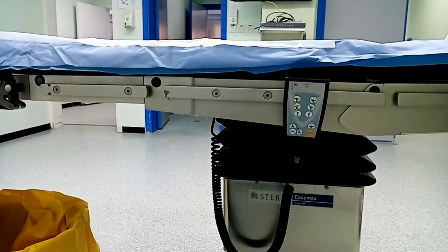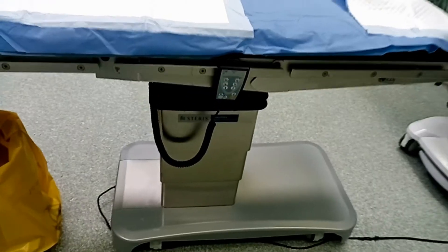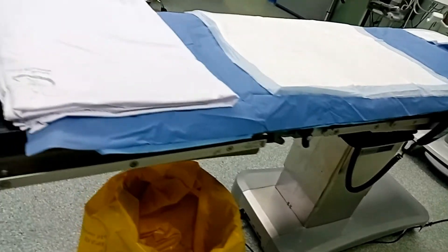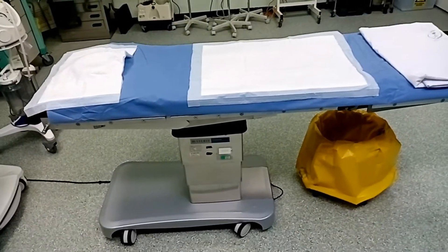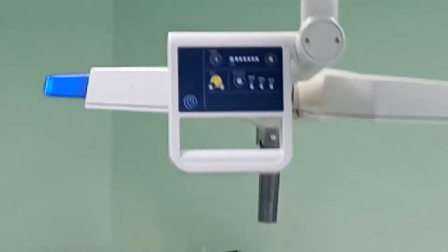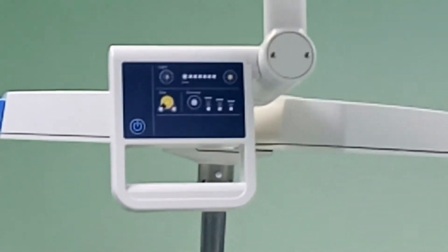الجزء العلوي هو الجزء الخاص بالمريض. الطاولات بتختلف: في طاولات عظام، جراحة، مسالك، ولادة. كل طاولة مصممة للغرض المطلوب. دي طاولة جراحة عادية، بتشتغل بالكهرباء وفيها بطارية في القاعدة للشحن، يعني لو الكهرباء فصلت هتشتغل.